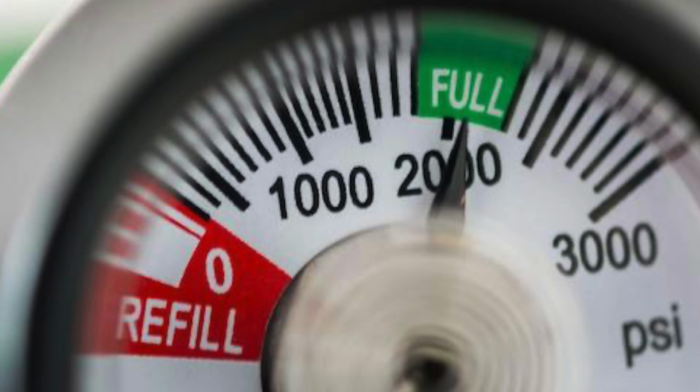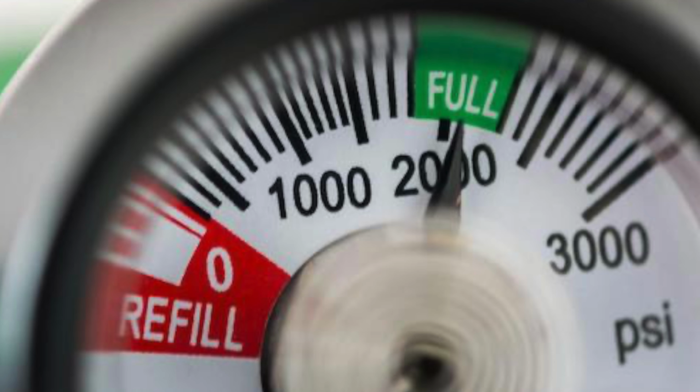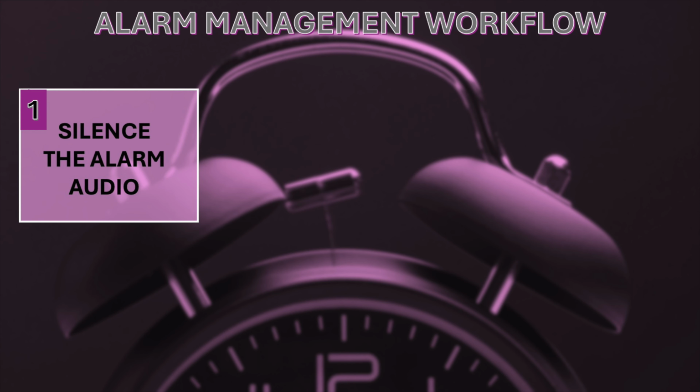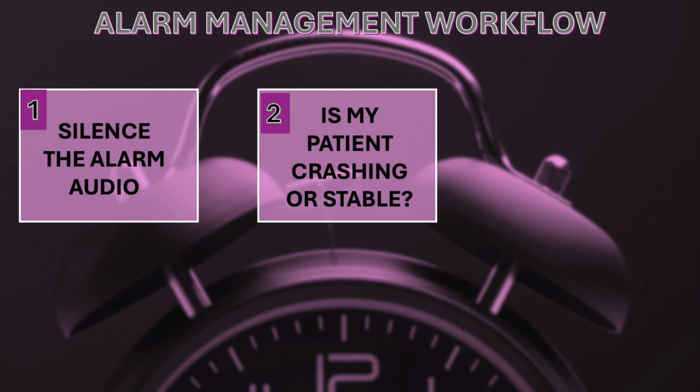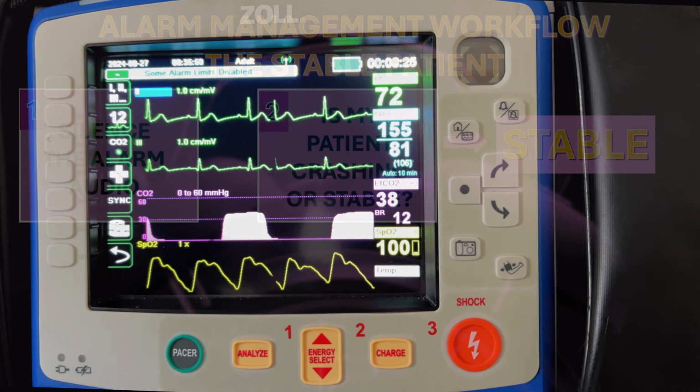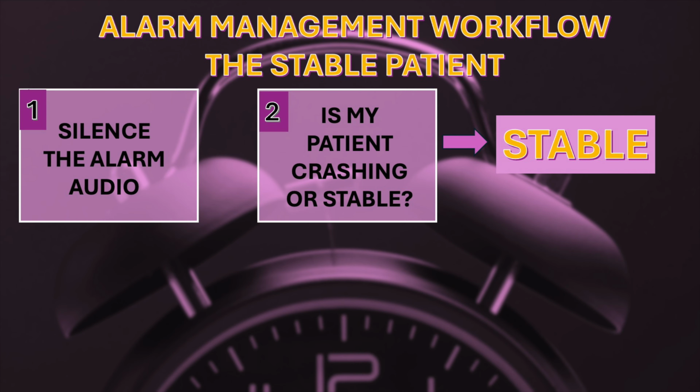If the alarm sounds, follow the alarm management workflow. 1. Silence the audio. 2. Is the patient crashing or stable? There is no cyanosis and all physiological parameters are normal. The patient is stable.